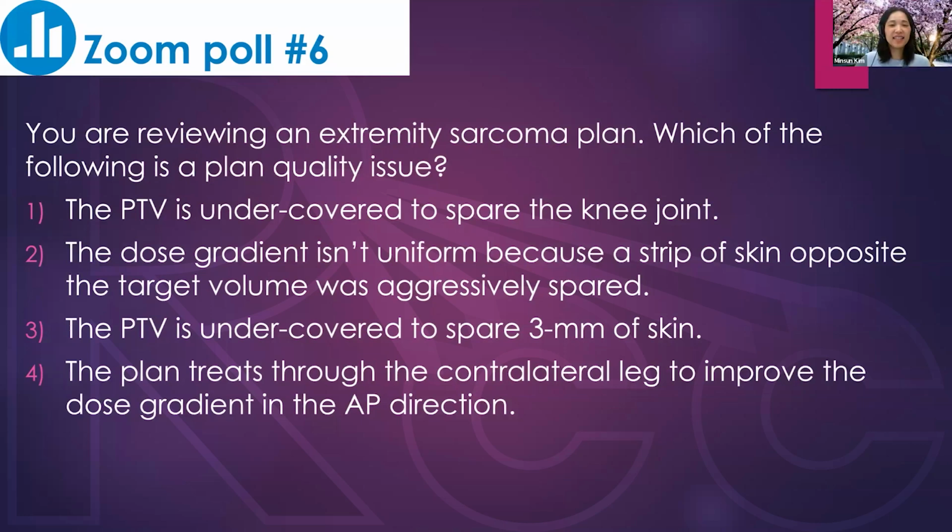I don't remember all the details, so I'll write that question down and get back to you on that. Minsun, do you know off the top of your head? No, I mean, it looks like the one that you showed was a T2 weighted. Yeah, that was a T2 image set. But I typically get like 2 or 3 different MRIs to fuse. I want to make sure I provide the right answer, so we'll circle back on that one.